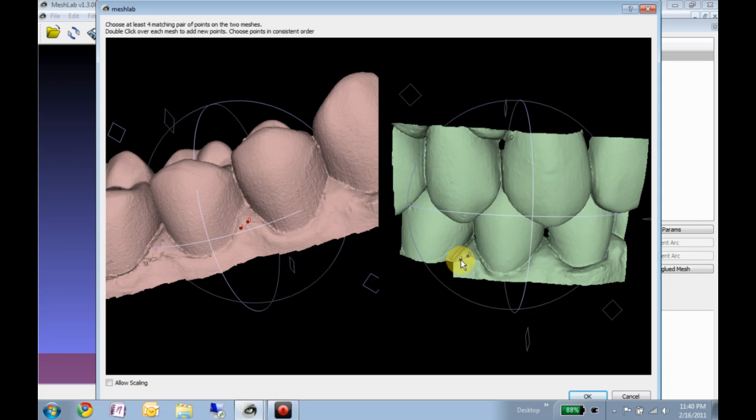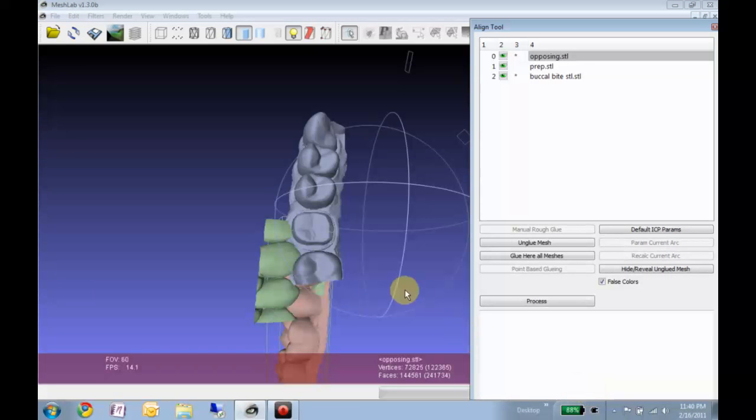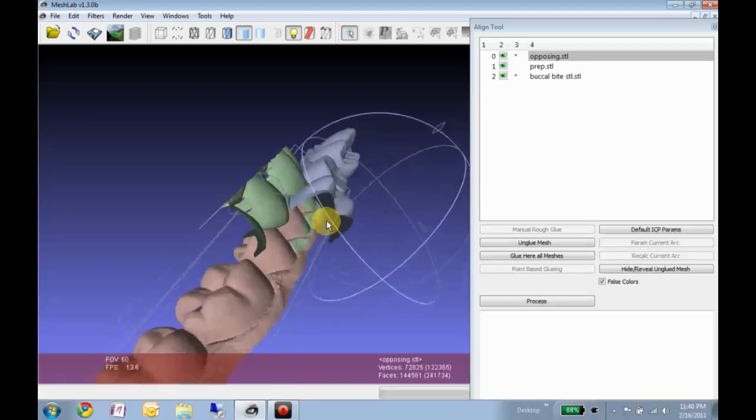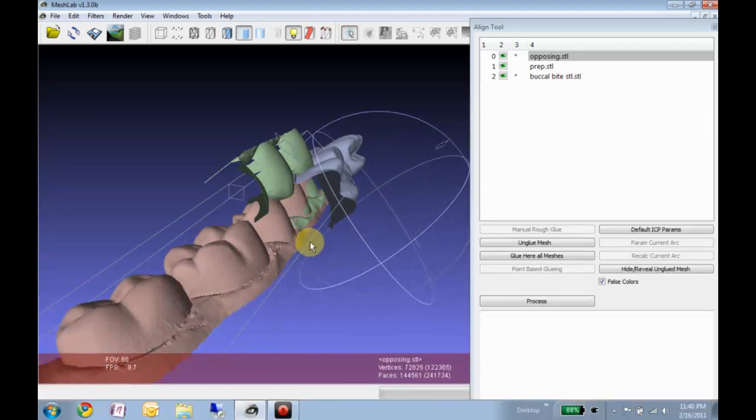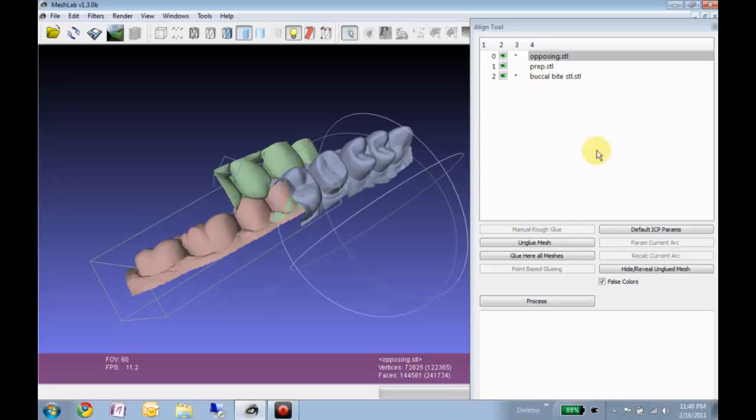Let it snap them into place, and then life will be good. You don't have to be too meticulous here, you just want roughly the same thing. And if this weren't blocking, you would see that this is more or less close by.